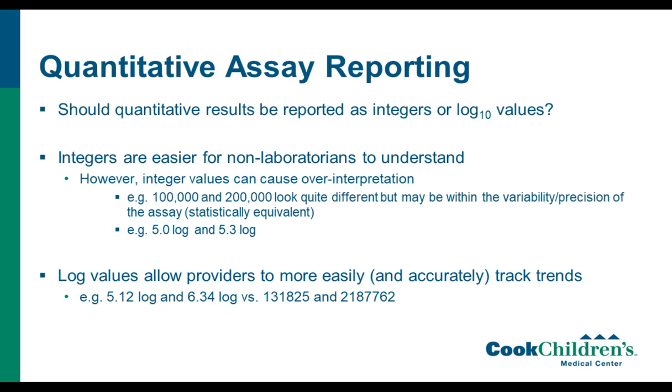There's not really a defined better or worse, and a lot of labs will report both the integer value and the log value. We have switched over to reporting only the log value, and we did get a little pushback at first, but we provided the physicians the information with how much variability there was in our assay, so look for this much for it to be considered a true change. And they've since adjusted to that.